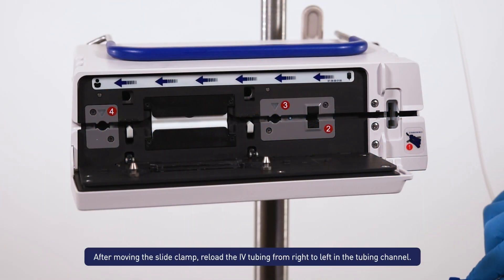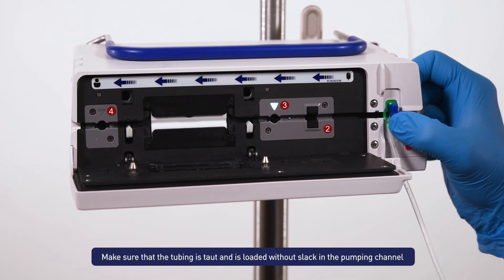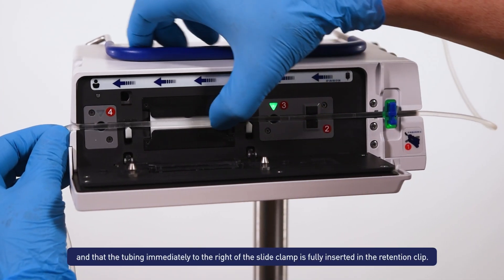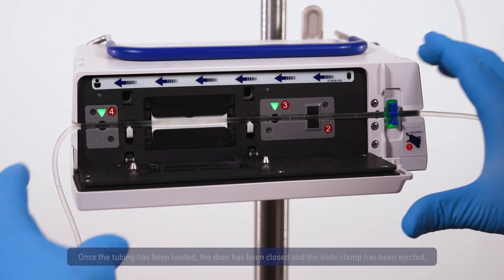After moving the slide clamp, reload the IV tubing from right to left in the tubing channel. Make sure that the tubing is taut and is loaded without slack in the pumping channel, and that the tubing immediately to the right of the slide clamp is fully inserted in the retention clip.